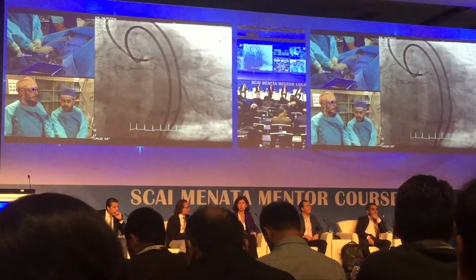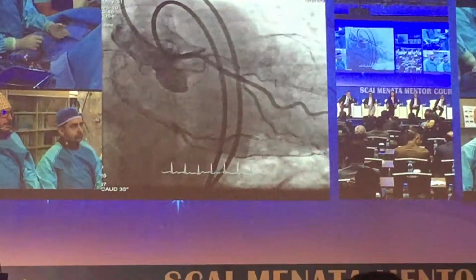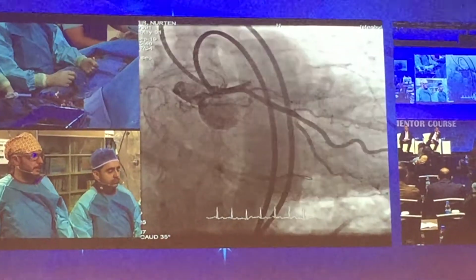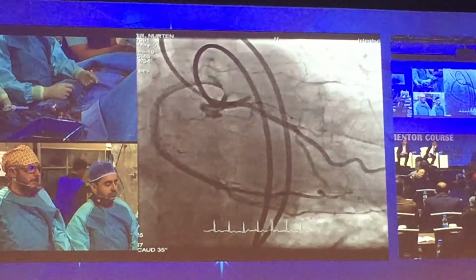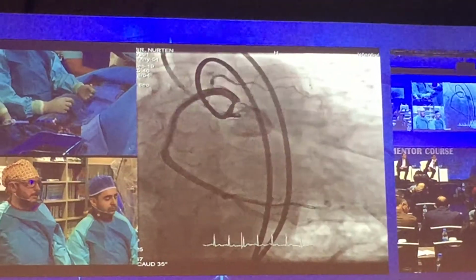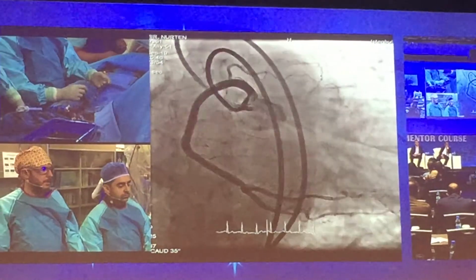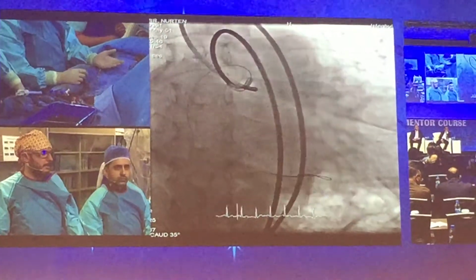Yeah. Okay. Nihat, the panel is thinking as you think, they are all starting with an antegrade option, and they offered some wires, but we are watching you, and do you want to say anything? Yes, at the beginning in the presentation, they said that it's the 5th attempt. Is it the 5th attempt of the CTO or is it the 5th PCI of that patient? So I would like to learn about that. For example, if this is the in-stent restenosis and after 5 attempts of opening it, of course probably retrogradely, probably you can go first.